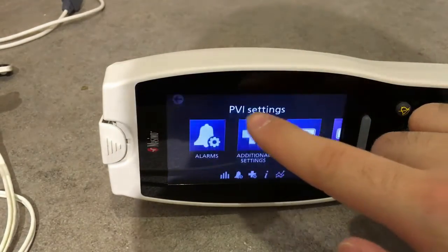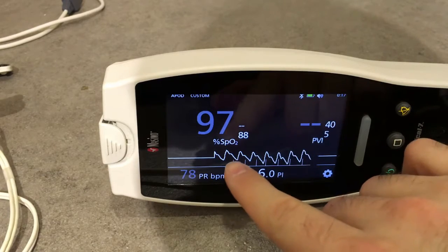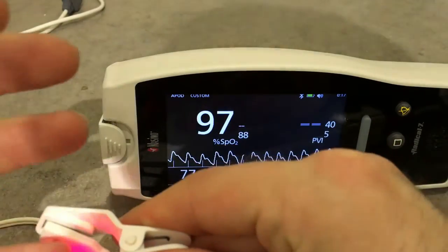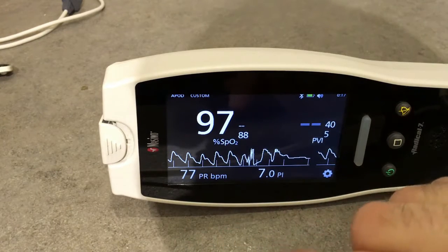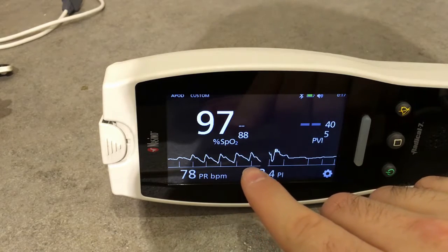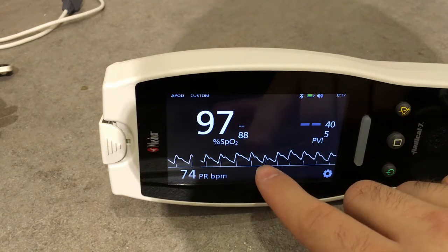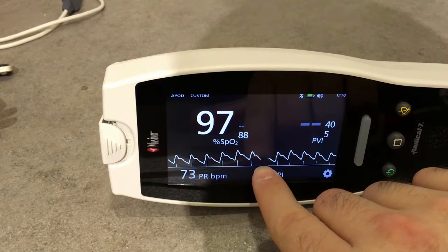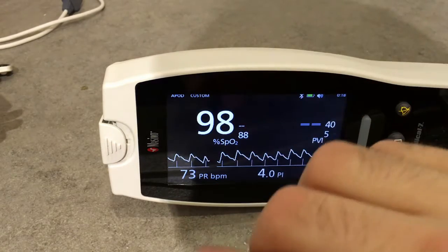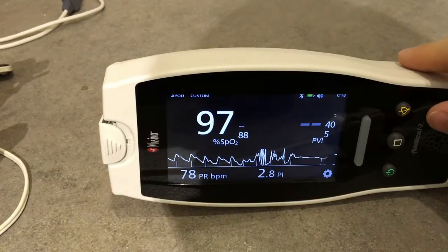Now it's searching for the pulse. The screen is very sensitive. As you can see there are those little lines — they're becoming quite tall. Let's change position because I want to show you the Signal IQ technology. The taller the lines are, the better the quality of the signal. This is the Signal IQ technology of this pulse oximeter.